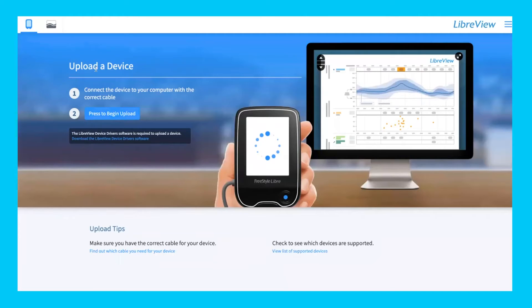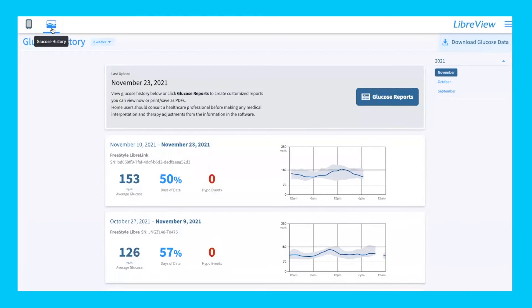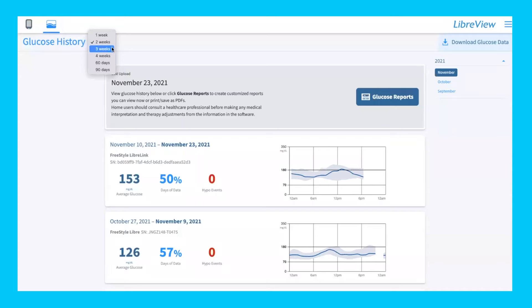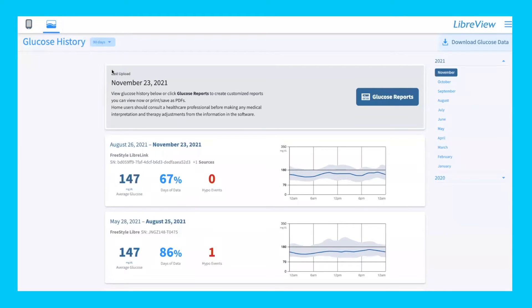Once you upload your Freestyle Libre sensor and monitor, it'll show you this next page with your results. At the very top, you can select how to view your data. Each sensor lasts 14 days, but after those 14 days, this is where you can see all your past history from other sensors. You can look at one week, two weeks, three weeks, four weeks, 60 days, and 90 days. We'll go ahead and look at 90 days.